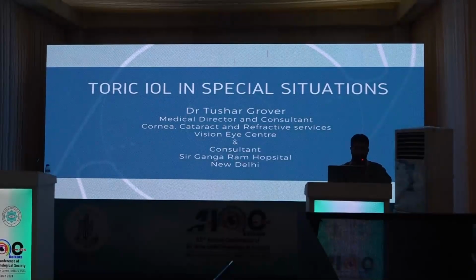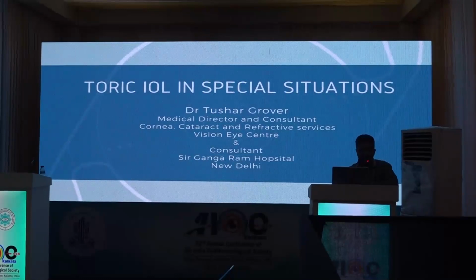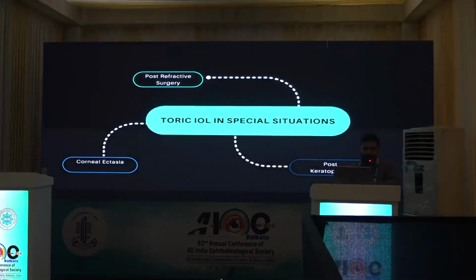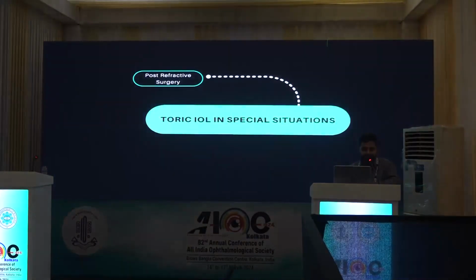Toric IOLs in special situations: where you can do them, where you cannot do them, and where you should be aware of the challenges involved. So the specific case scenarios that I'll be discussing are eyes that are post-refractive surgery, those with corneal ectasia, and eyes that are post-keratoplasty. So let's start with post-refractive surgery eyes.